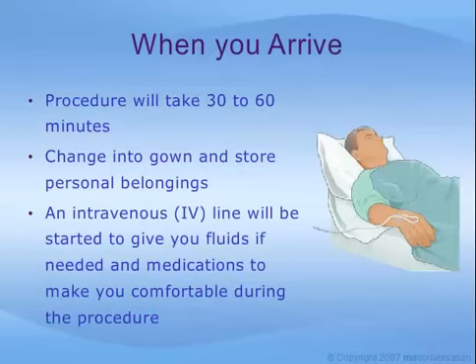attention. When you arrive, you should expect the procedure will take 30 to 60 minutes and may be done in your clinic or hospital. The mild sedative and pain medicine should keep you from feeling much discomfort during the exam. Expect to remain at the colonoscopy facility for 1 to 2 hours following your procedure so the sedative can wear off. Be sure to have someone available who can drive you home once you have recovered.